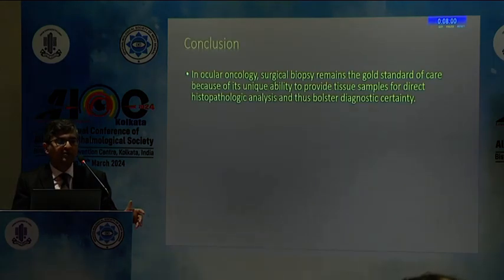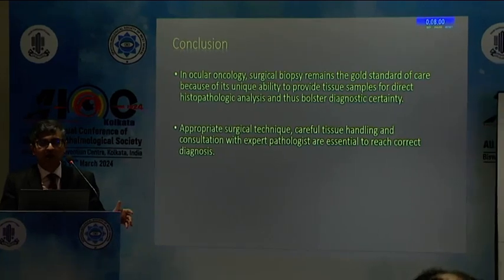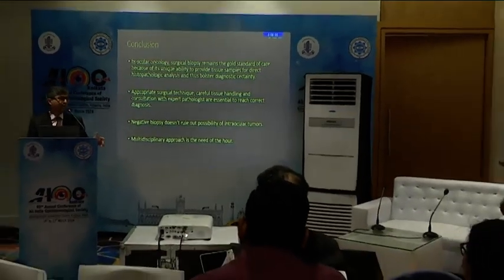In ocular oncology, biopsy still remains the gold standard. Appropriate surgical technique with careful tissue handling is very important, and a negative biopsy does not rule out any possibility of intraocular tumors, and a multidisciplinary approach is the need of the hour.